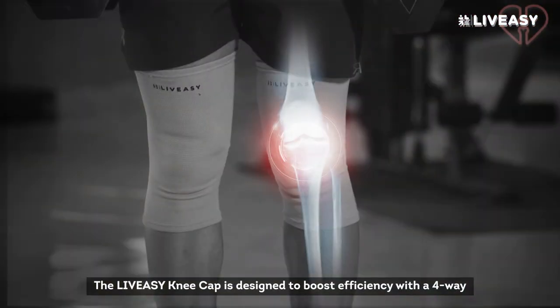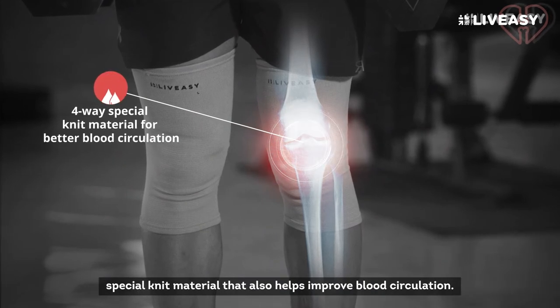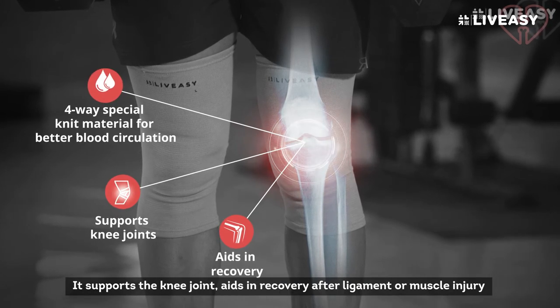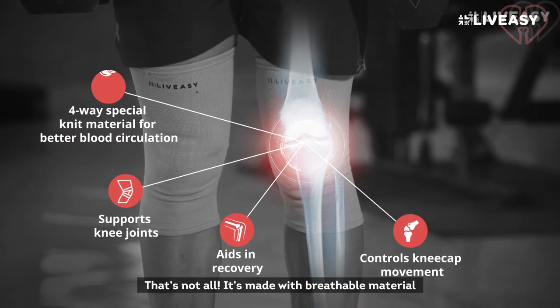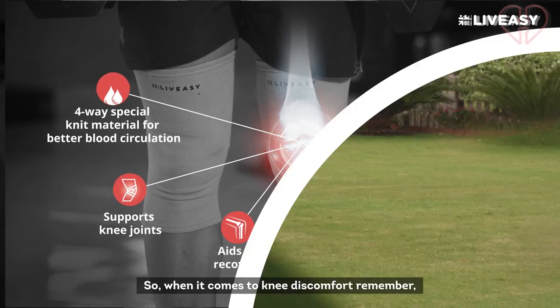The LiveEasy kneecap is designed to boost efficiency with a 4-way special knit material that also helps improve blood circulation. It supports the knee joint, aids in recovery after ligament or muscle injury, and controls the movement of your kneecap. It's made with breathable material for enhanced comfort and better performance.